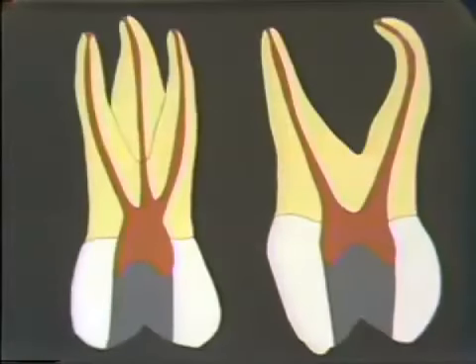You come in from the distal lingual, and you'll go right into the mesial buccal canal. You come in from the mesial lingual, and you'll get into the distal buccal canal. And if you come in from the buccal, you'll go right down into the lingual canal.